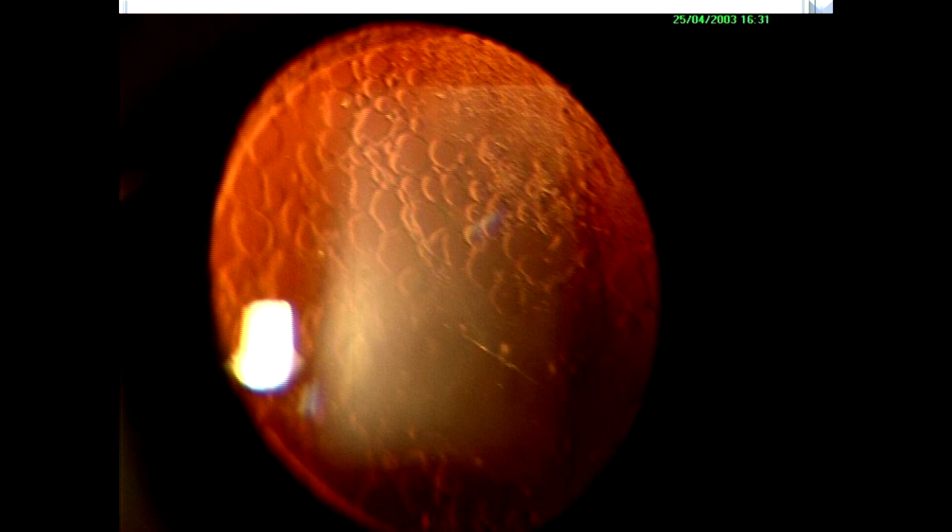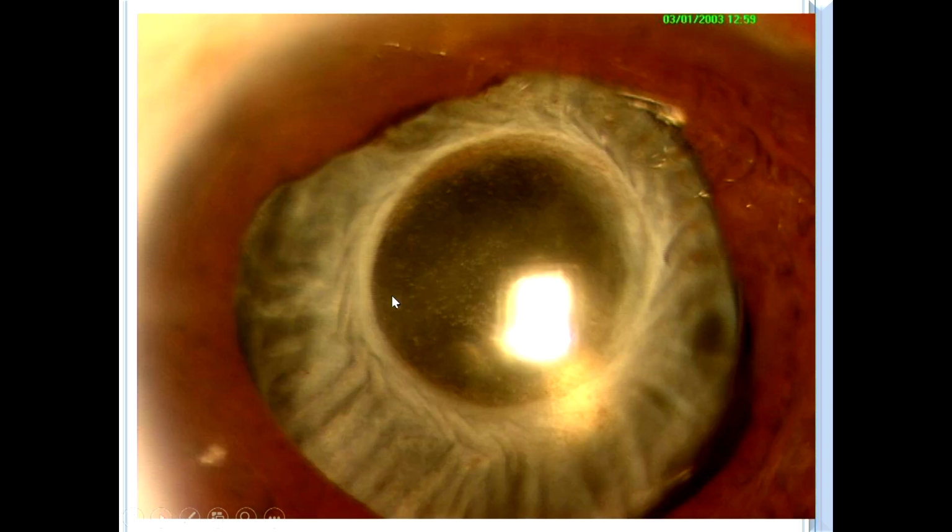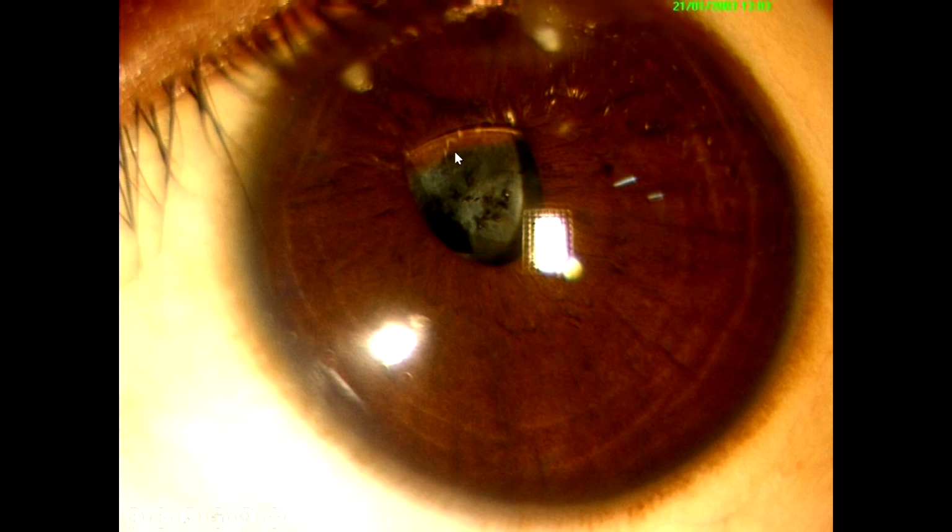But post-surgery, posterior capsular opacification is something which is a major concern. It can manifest in various forms like this. You can have thick fibrotic membrane. You can have phimosis of the anterior capsule. You can have even the decentration.